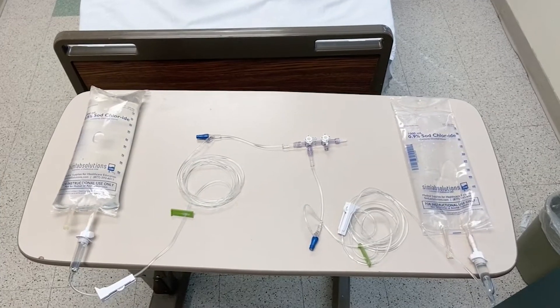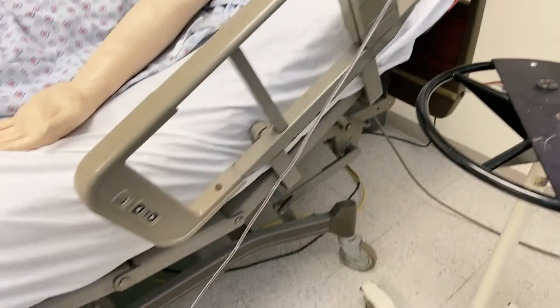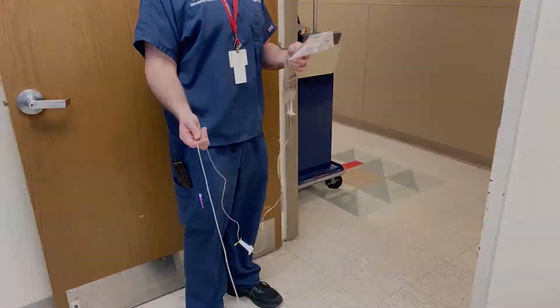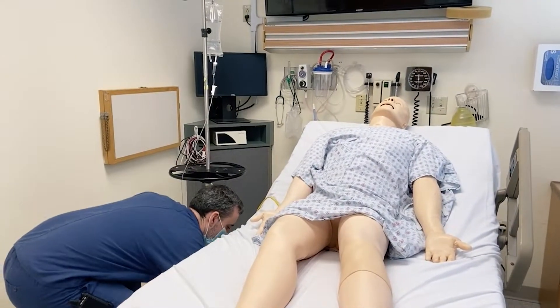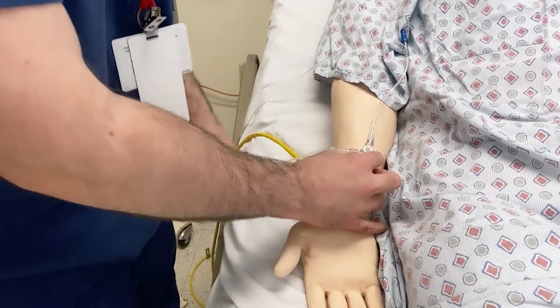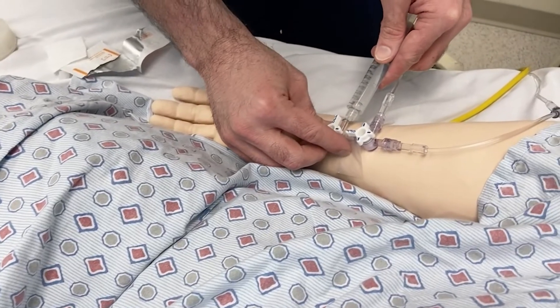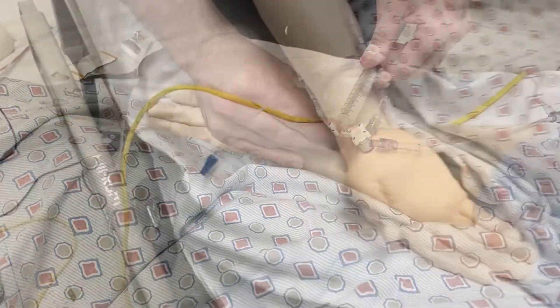What you're doing is creating a drainage system. A participant in a scenario could push fluids or drugs and the liquid from the event will just go to your drain bag. Once you're connected to the mannequin, you're off and running. You can give fluids, you can push meds, and it will all go to a safe, clean space on the floor in your drainage bag.